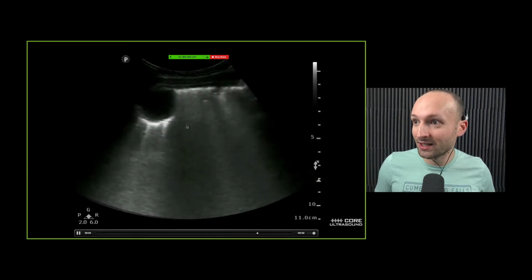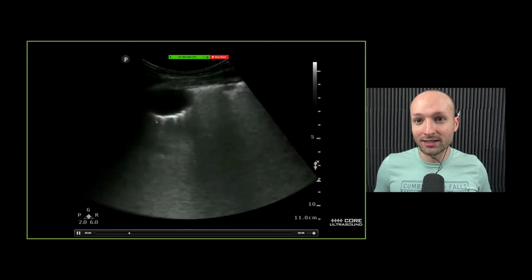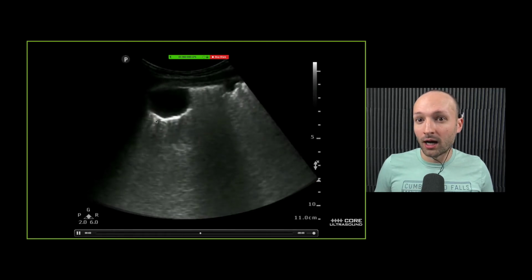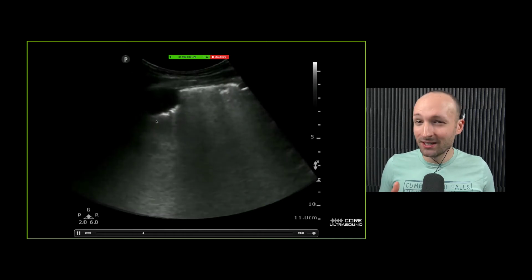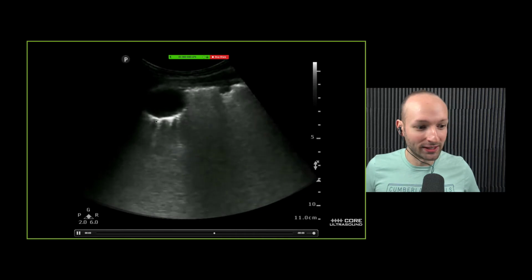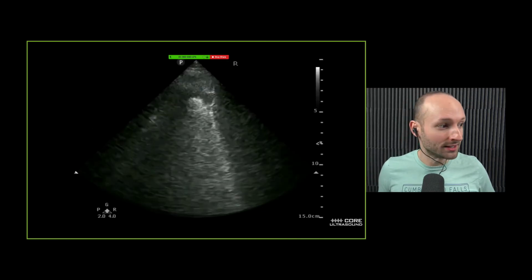It is lung cancer. So usually when I see something nice and round in a patient that is not super sick but has had some B-type symptoms, I'm much more likely to think something like this is actually a cancer. It's just another thing that can cause it.